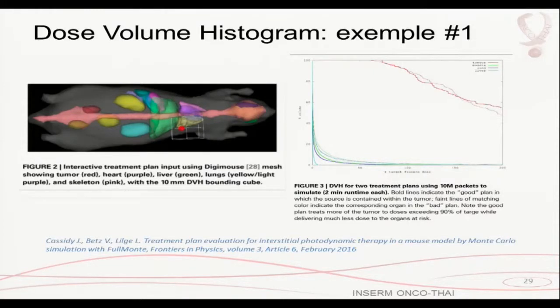Unfortunately, there is no projector, but you can see here that the dose is inside the tumor and the normal tissue didn't receive any harmful dose. You can really protect it by proper selection of light and proper positioning of the fiber. You can treat the tumor and protect the surrounding tissue. And if I show that to a radiation oncologist, he will understand.